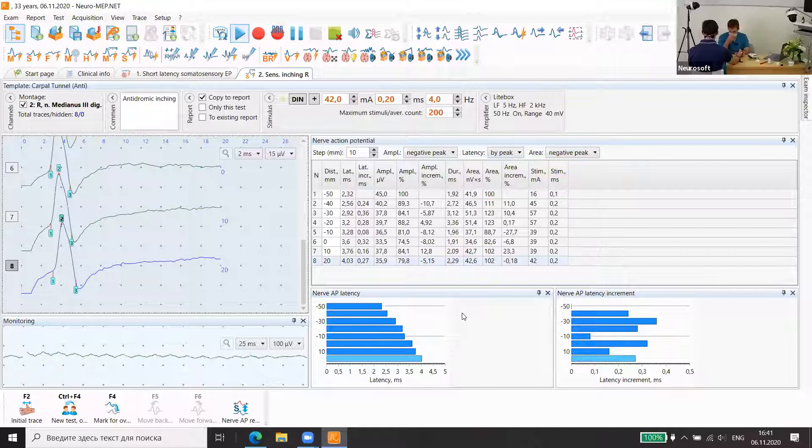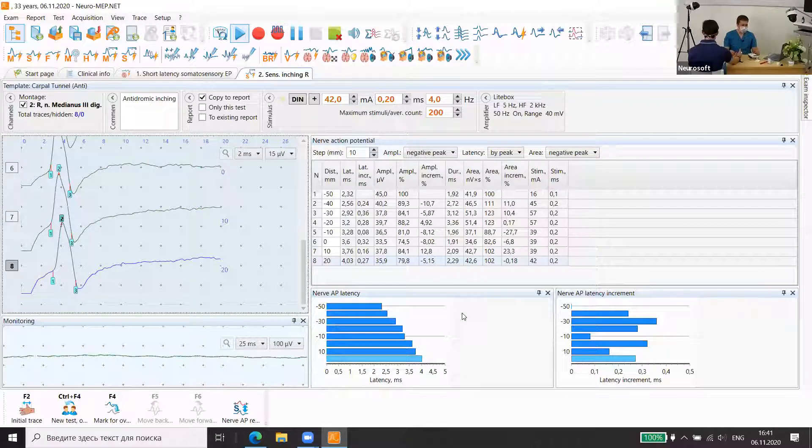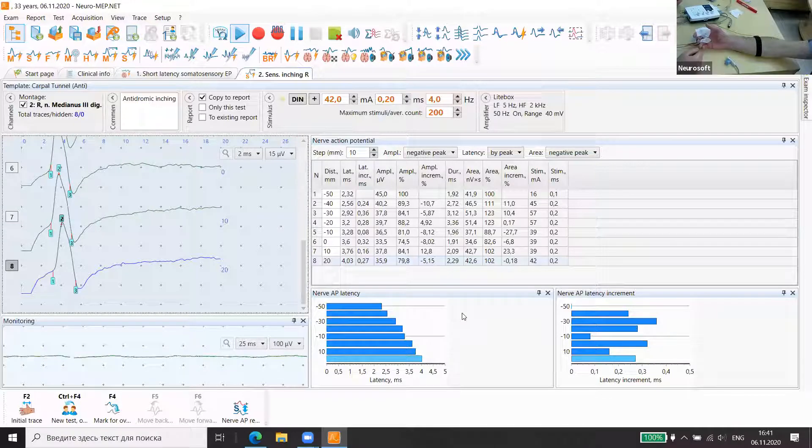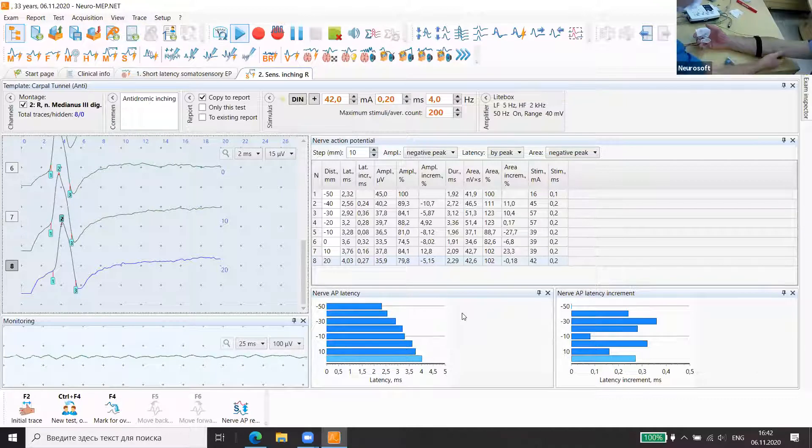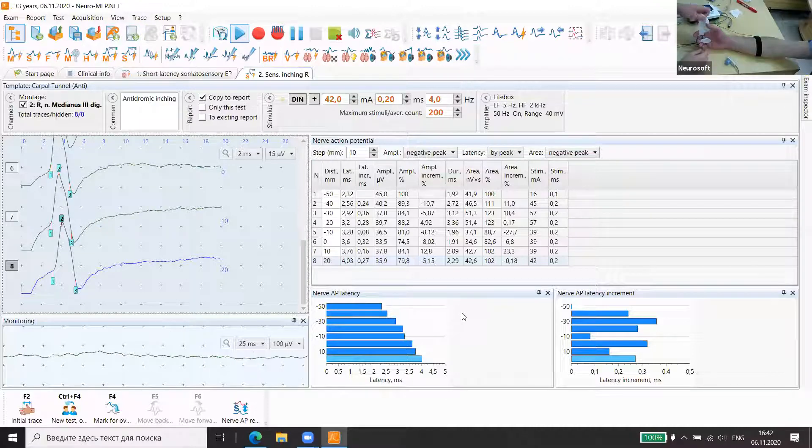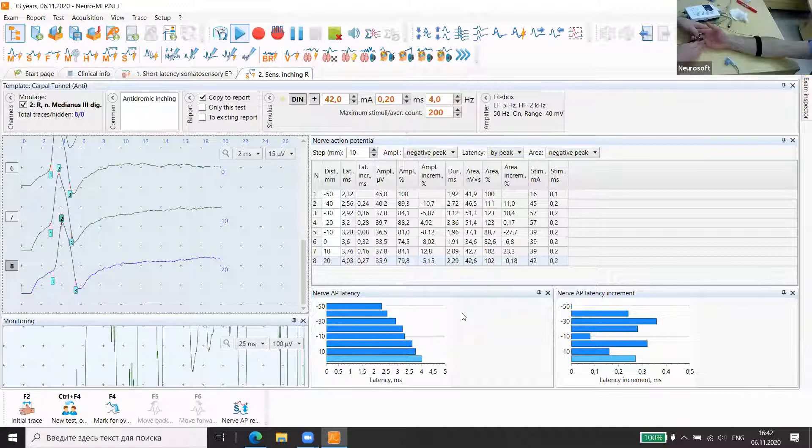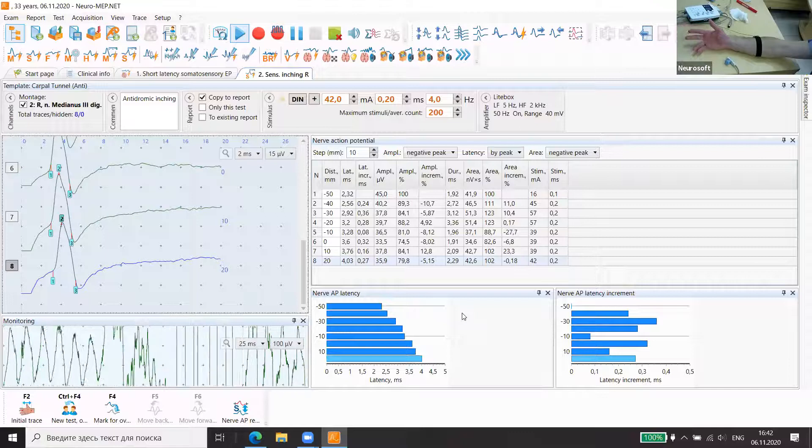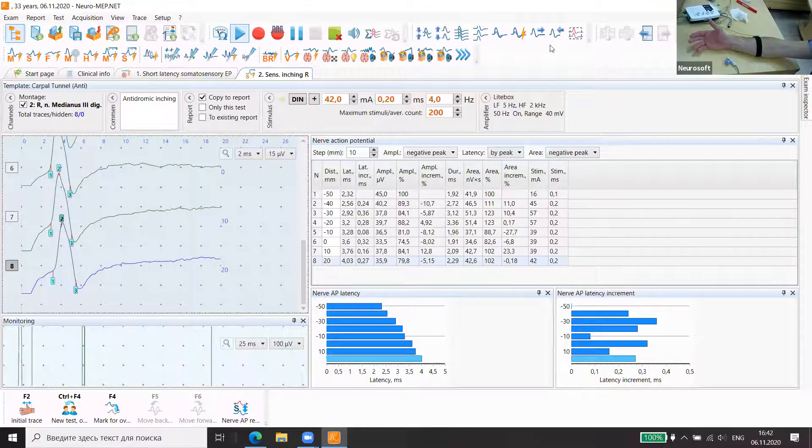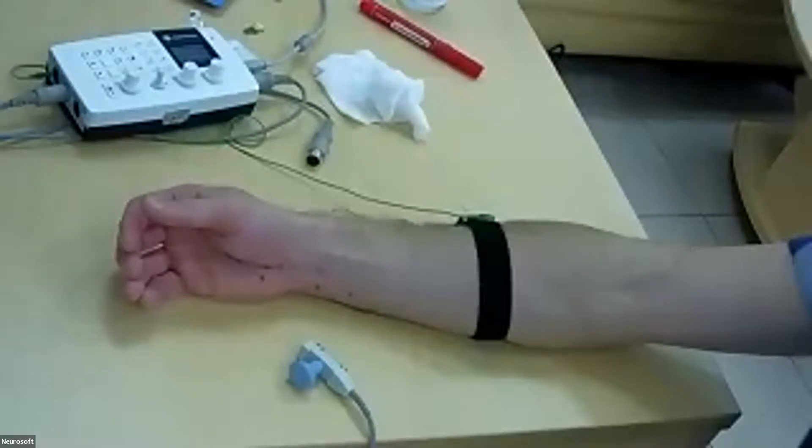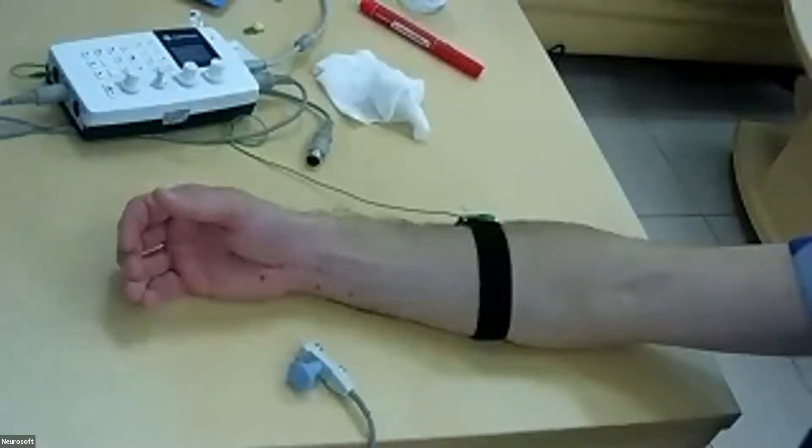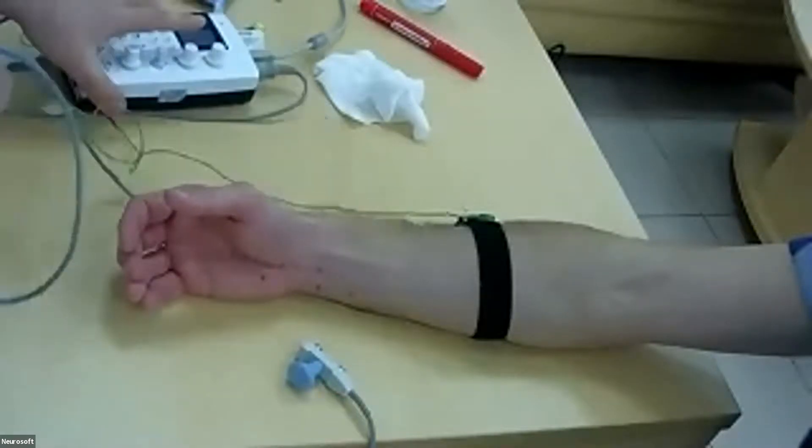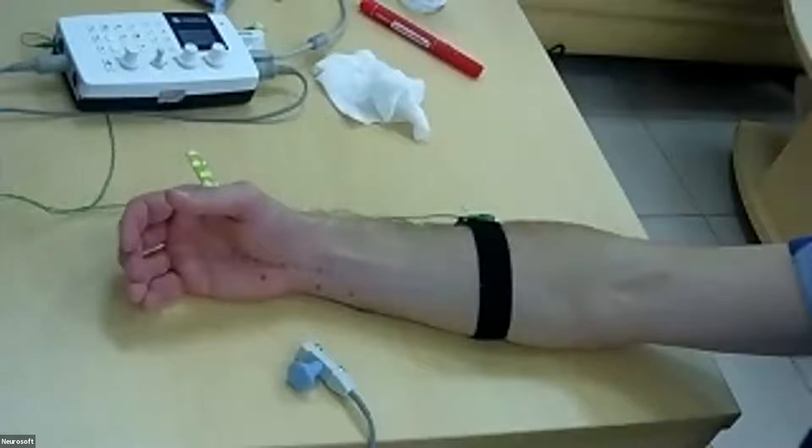Now we will develop partly motor inching. If we use sensory inching mostly for carpal tunnel to localize position, motor inching is mostly developed for elbow level. But today we will do it with the ulnar nerve. But we will show it for the median nerve too, for abductor pollicis brevis.